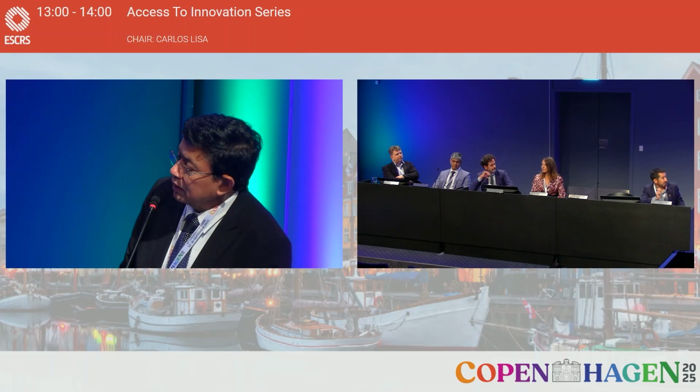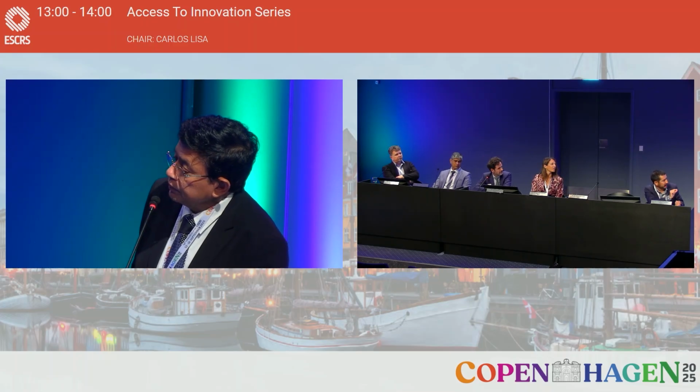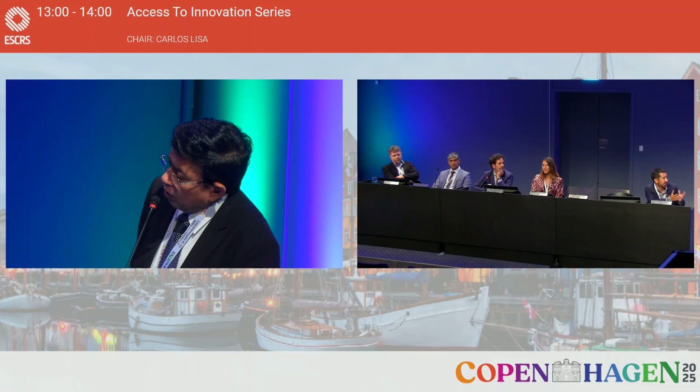Okay. Is there any patient that you wouldn't recommend this lens to? Because you're inducing some spherical aberration, right? So maybe in patients with high order aberrations, you wouldn't recommend this lens. Absolutely.